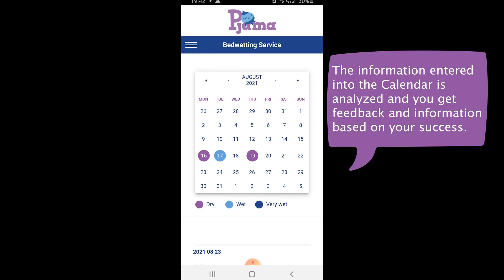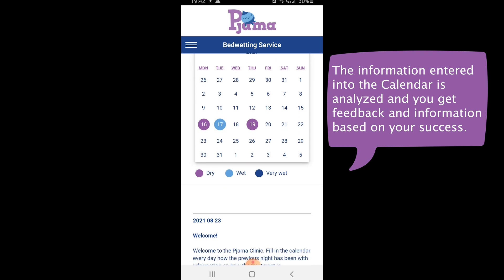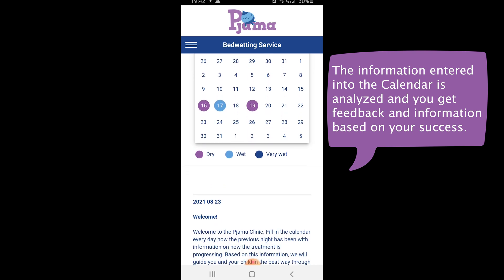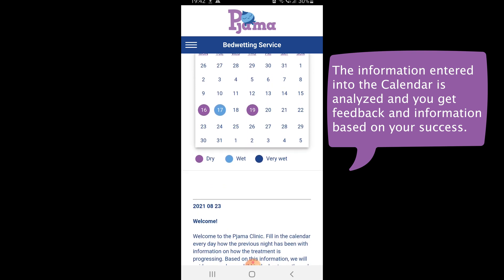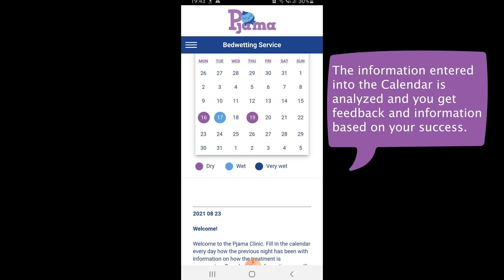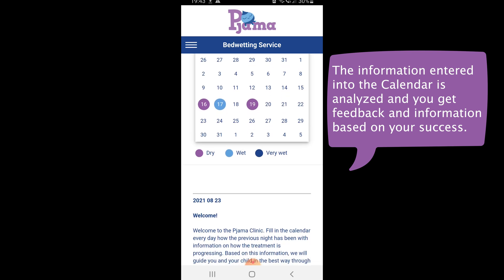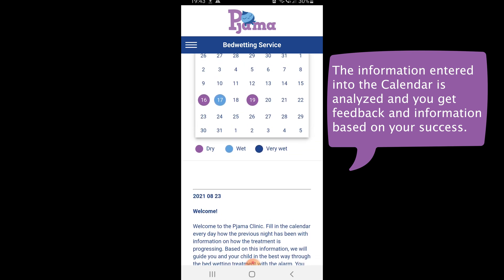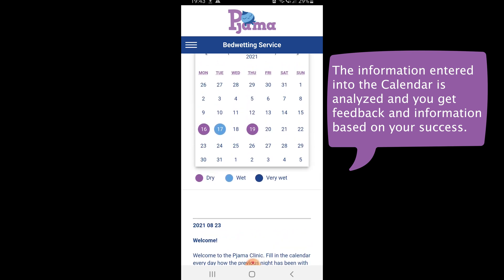The calendar entry information is analyzed and you will see messages related to your progress shown below the calendar, to guide you in the best way through the bedwetting treatment.